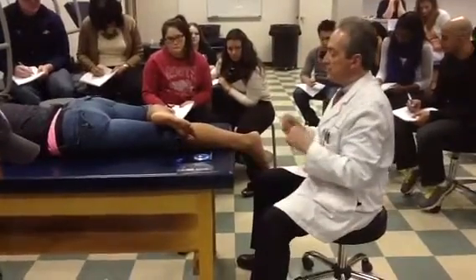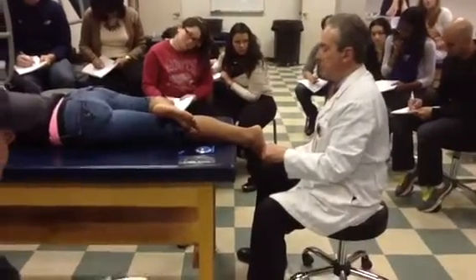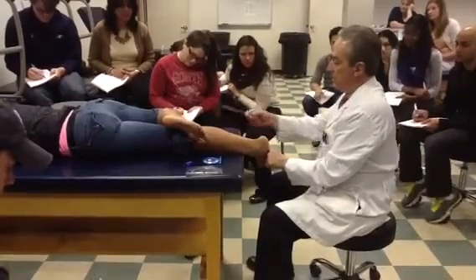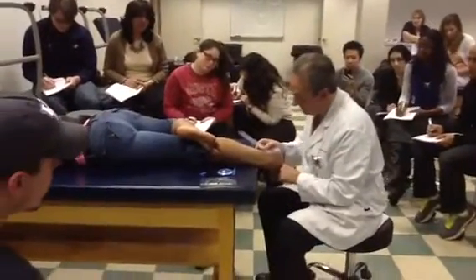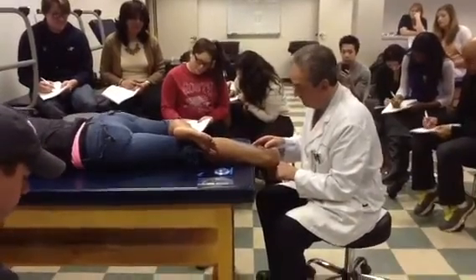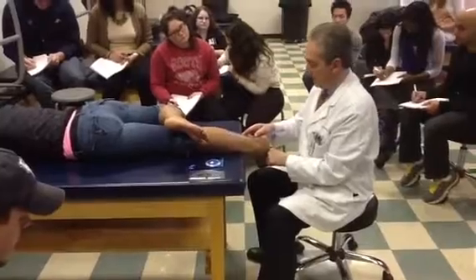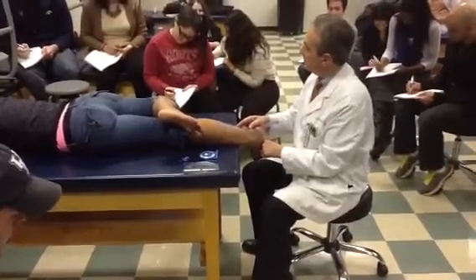Okay? I'm going to use the tractograph just for starters to show you because it's easier to find your reference lines and see what we're looking at. First thing I'm going to do is adduct the forefoot, which will invert the calcaneus. All right? Put my measuring tool. First thing I'm going to do is bisect the calcaneus, find that pivot point, bisect the lower 1/3 of the leg, and that is my subtalar joint inversion measurement. Okay? In this case, our patient has 22 degrees of inversion.